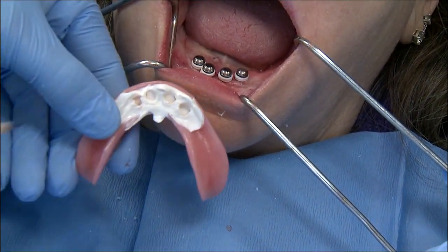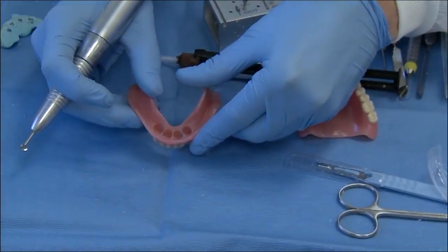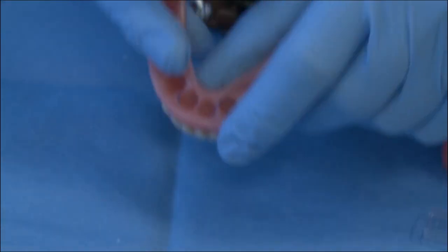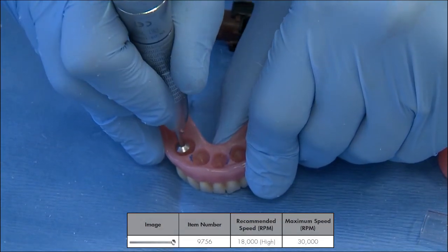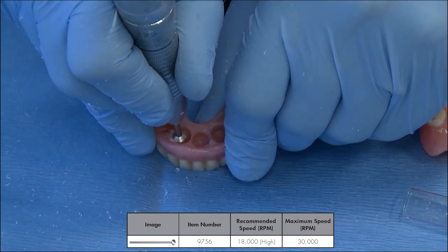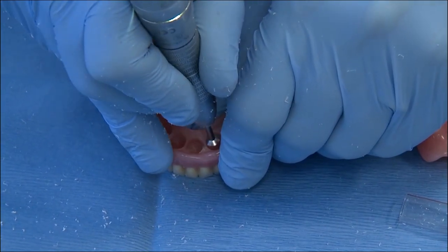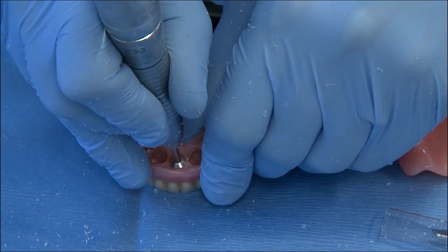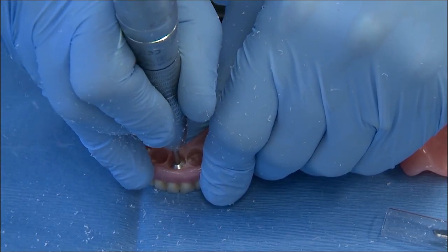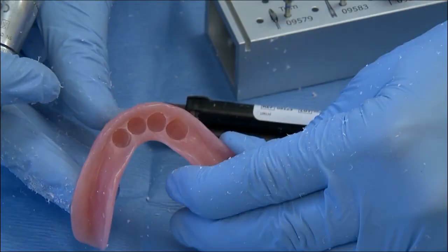I like to use a red-blue pencil, preferably on the blue side, just touching the edges of the fit checking material, allowing a little marking to transfer. The locator recess burr is so precise that it creates the perfect size hole. In a real-life situation like this patient, we've had to enlarge the hole just a little bit more. Using the burr at high speed, I deepen the recess hole plus enlarge it slightly in a lateral direction. Any areas of show-through identified by the fit checking material are marked in blue, and I use the recess burr to continuously enlarge the recess hole. Since the locator abutments are high here, I'm deepening the channels as well.